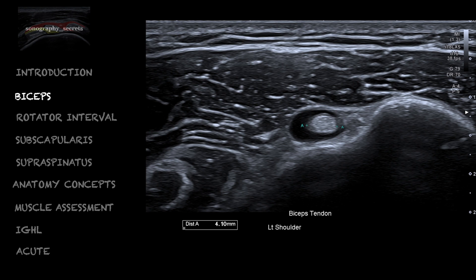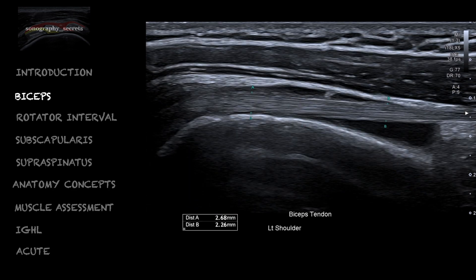These are the two images conventionally taken. We see a small amount of normal physiological fluid within the sheath of the biceps, both in short and long axis, but we need to ensure that we assess the tendon more proximally and down to the muscle bellies.